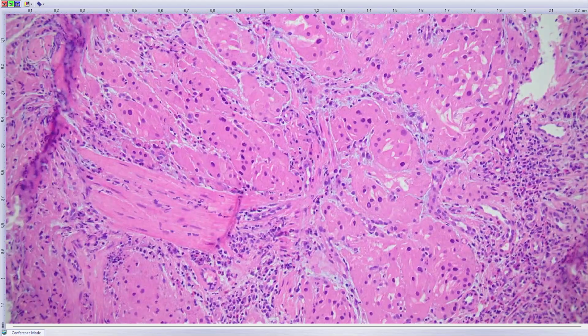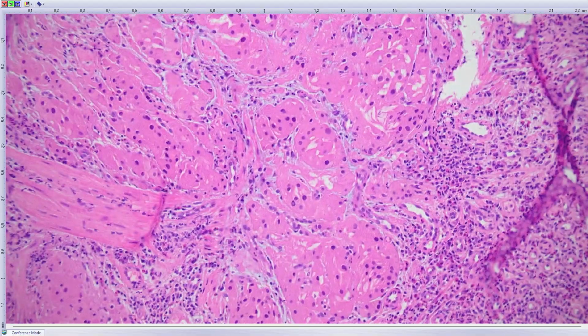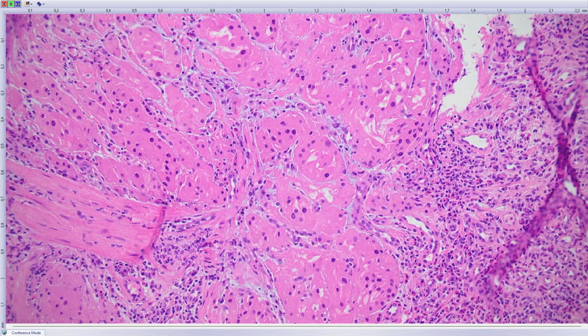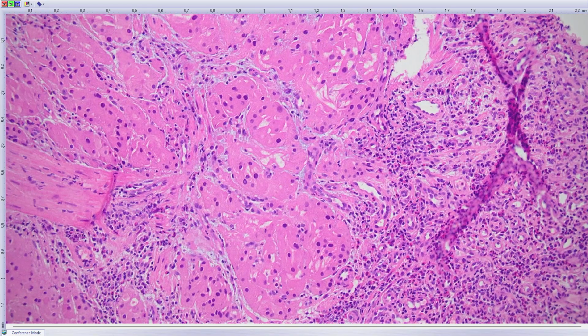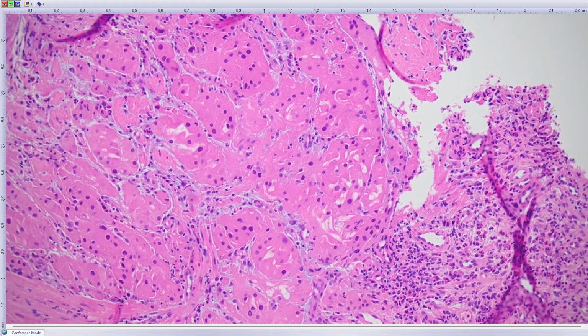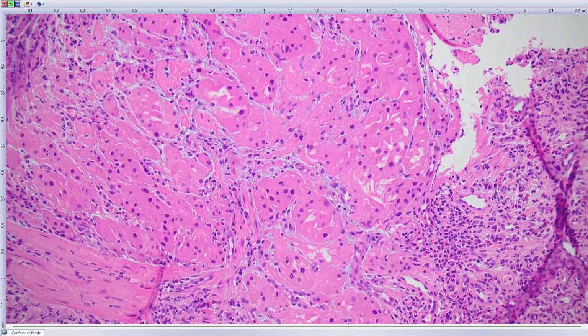And the biopsy came with a diagnosis because the referring pathologist performed some immunostains, and the lesion was positive for synaptophysin, and it was positive for chromogranin. And the question was whether it could be a very rare oncocytic variant of some well-differentiated neuroendocrine tumor. Of course, it could be, but I repeated chromogranin staining and it came out negative, okay? Synaptophysin was positive.